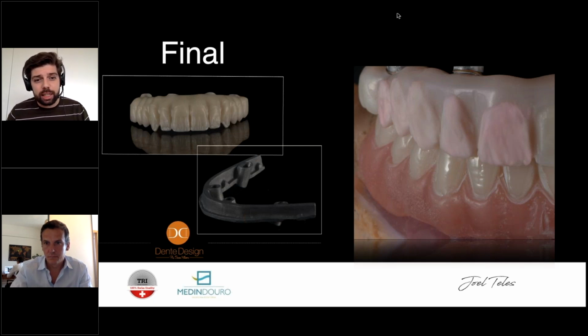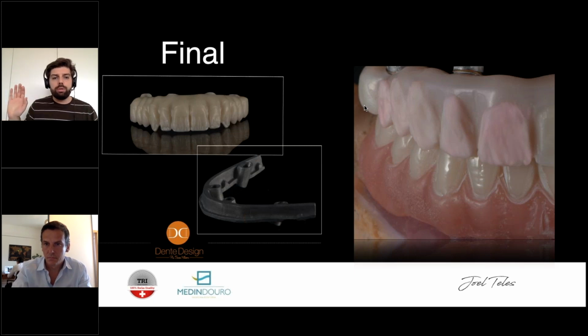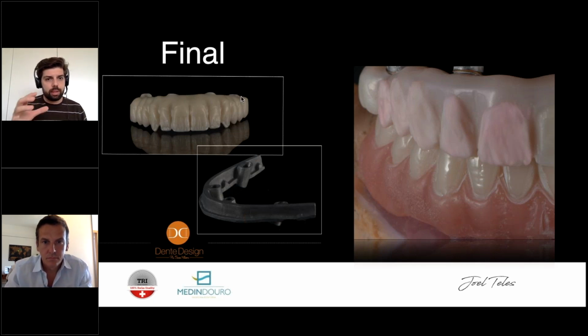And especially if you're dealing like this, what I still do with ceramic cutback with 0.5 millimeters. Okay, so these 0.5 millimeters should not touch in any movement that your patient does. Only what you see here, only the monolithic structure itself handles the forces. Okay, so it's very, very important. And in the posterior region, sometimes the teeth are left like this, only monolithics, no ceramic veneering whatsoever. The ceramic veneer is only for the smile aesthetic zone, and that's it. Okay, this is the positioning where your tie bases or your TTAs will be cemented afterwards.